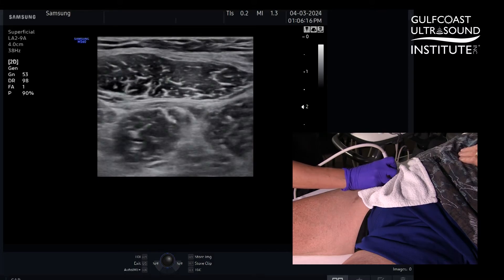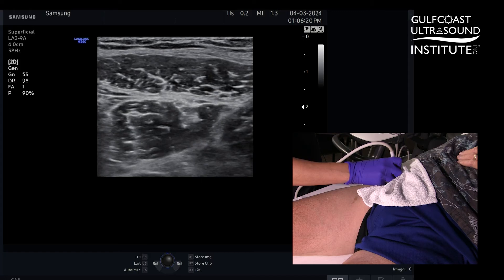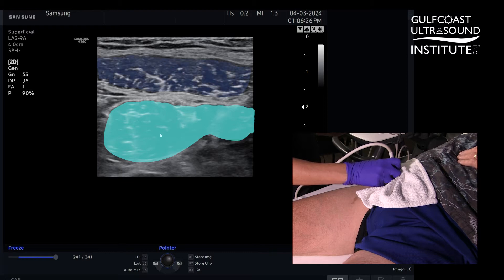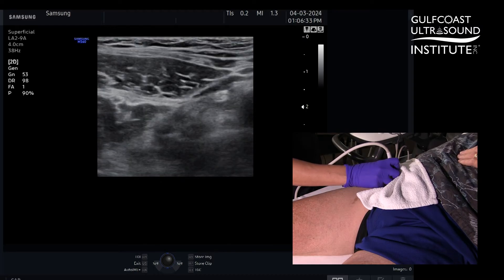Just lateral to that you see your hyperechoic femoral nerve. As you slide more lateral, there's a hyperechoic fascial plane separating two muscle bellies. In the far field is your large iliacus muscle and in your near field is your sartorius muscle. This fascial plane leads you to your femoral nerve.